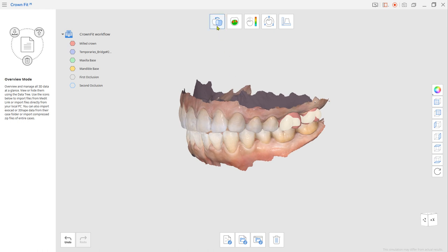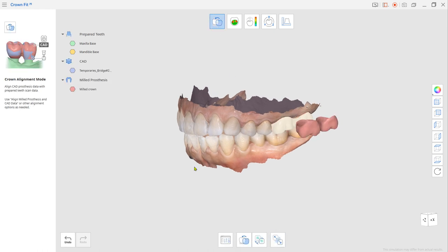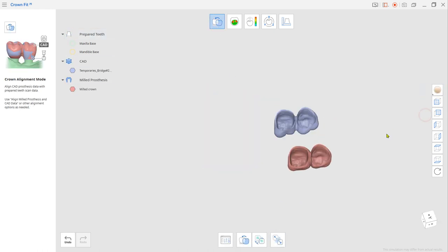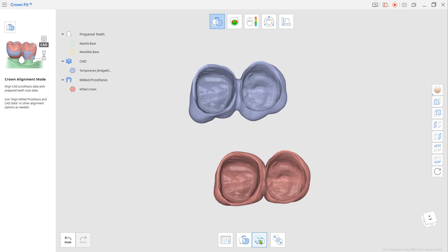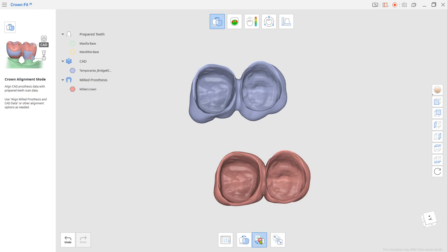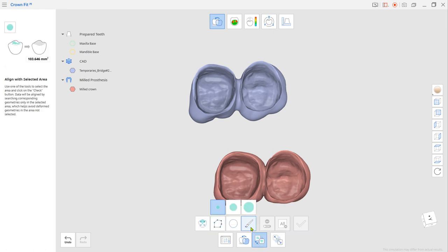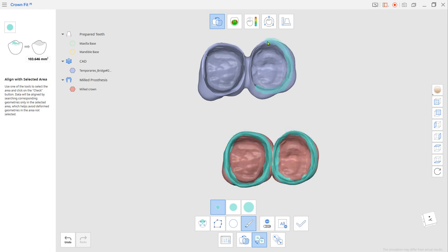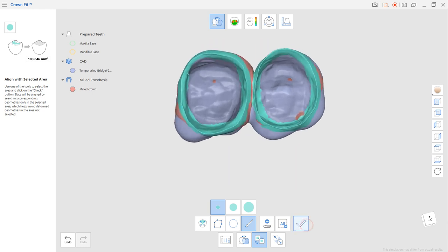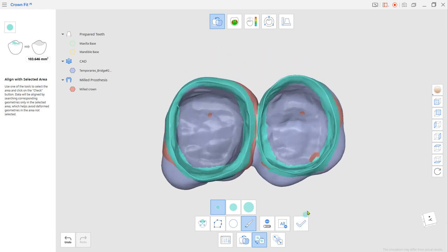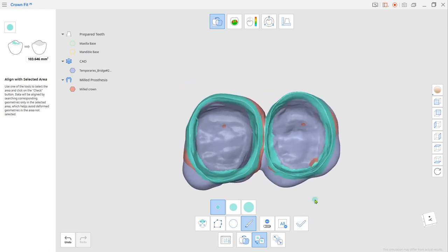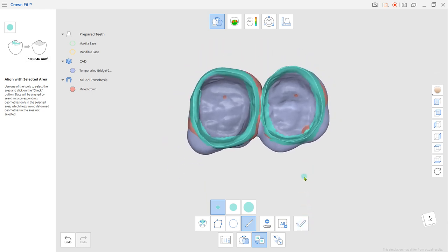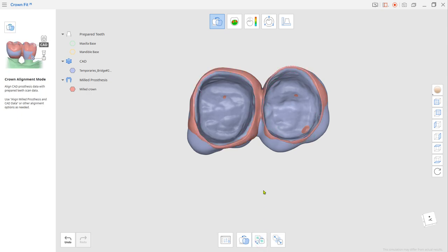If not, go to crown alignment mode at the top and choose align with selected area from the bottom. Use the brush tool to paint the margins from both crowns and click check. Now the milled crown has been located correctly based on the margin information.